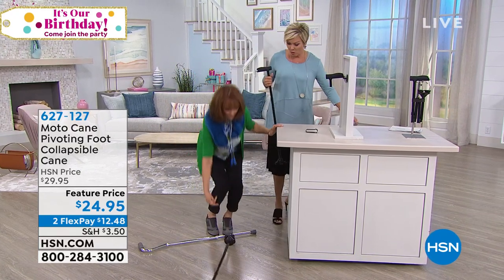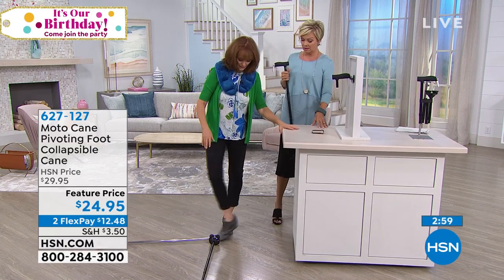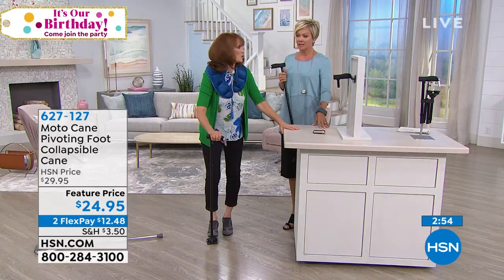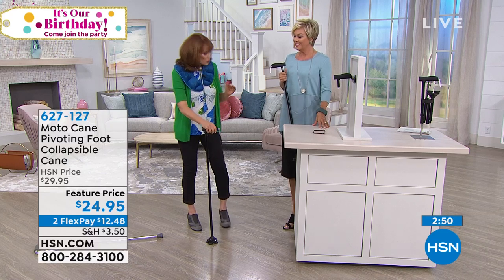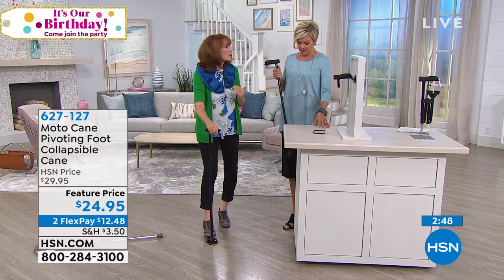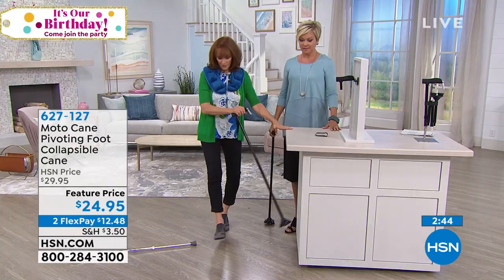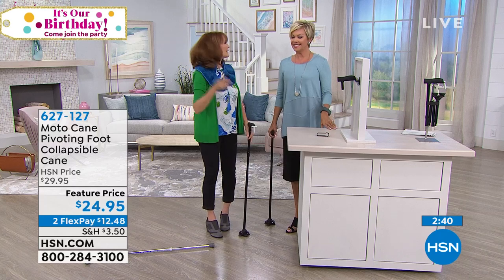What's cool about this one is that even if it falls — because it has four points of contact — if you accidentally drop it or kick it over, just step on it and bring it up to yourself. You can't do that with a single-point cane. That would be like, 'Could somebody help me?'